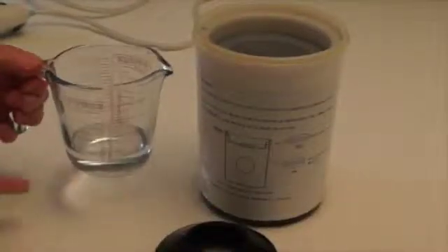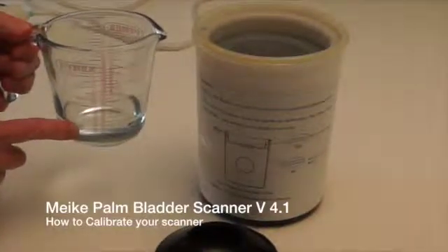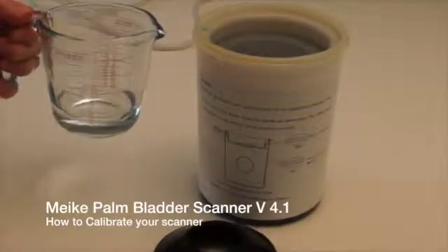Hello, my name is Roy Waldridge from WinHealth Ltd and I'm here today to talk to you about some of our new products. Today we're going to talk about how to calibrate the Meike Palm Bladder Scanner version 4.1.